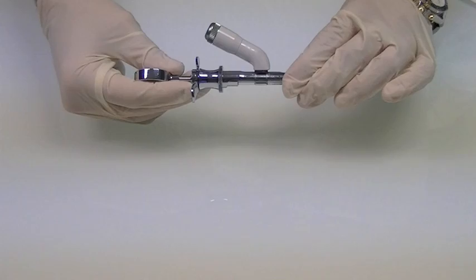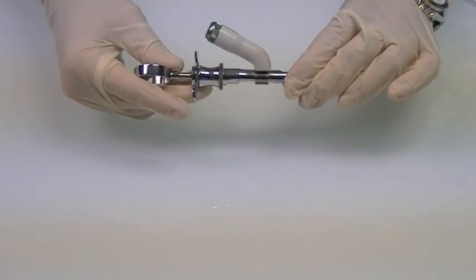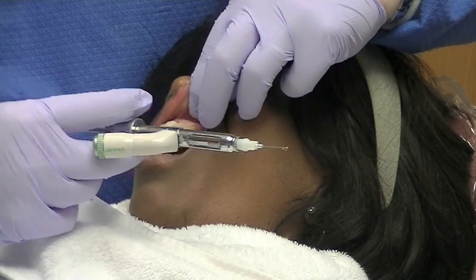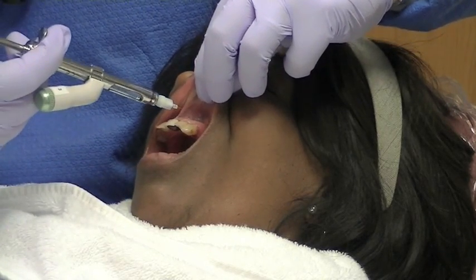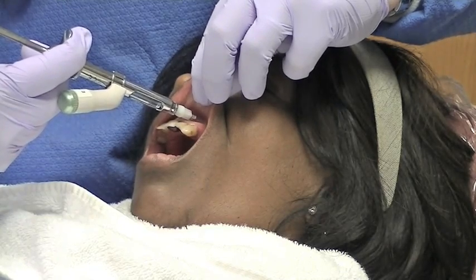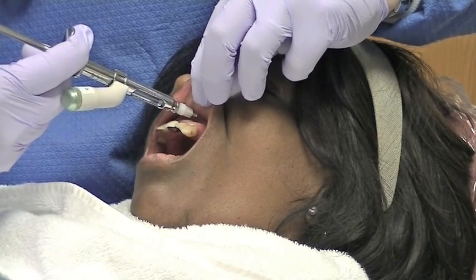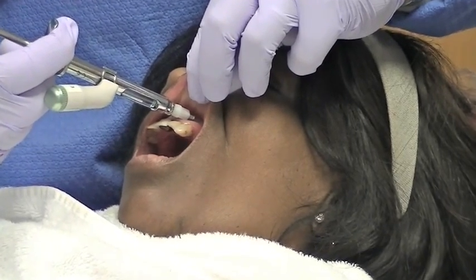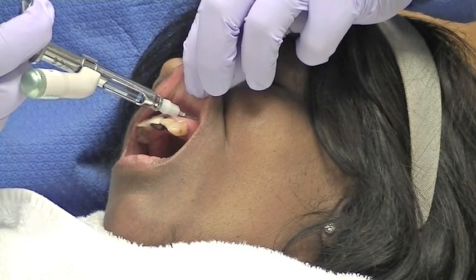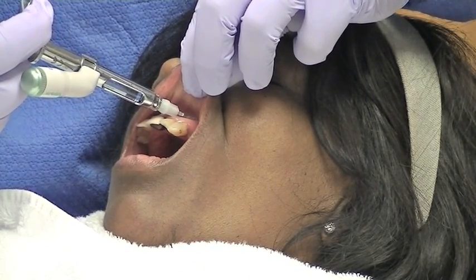It produces a mild vibrating sensation that helps override the pain signals from the needle. The nerve endings associated with sensing temperature and pain are small, uninsulated, and have a relatively low signal intensity. The nerve signals which respond to pressure and vibration are larger, insulated, and have a relatively high signal intensity.